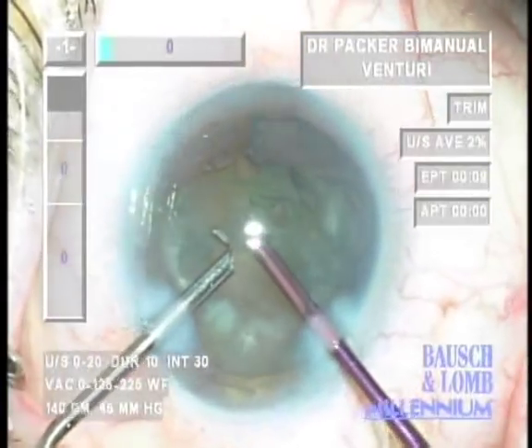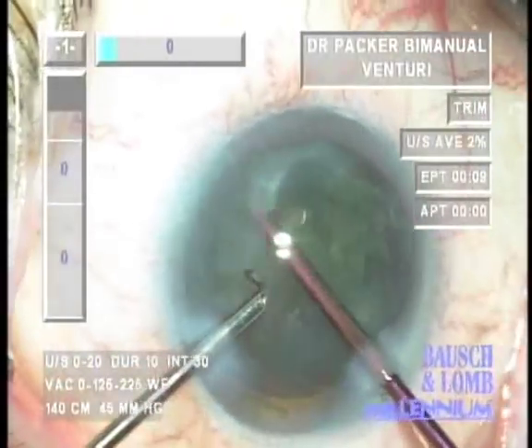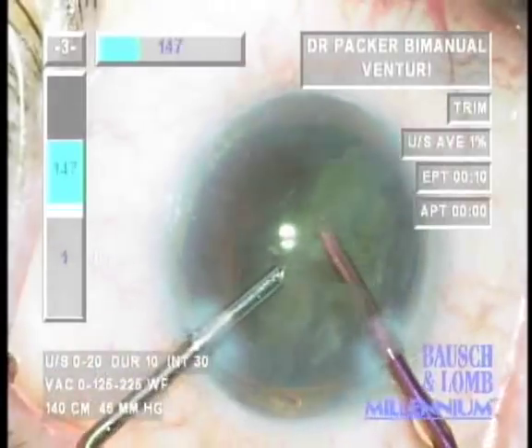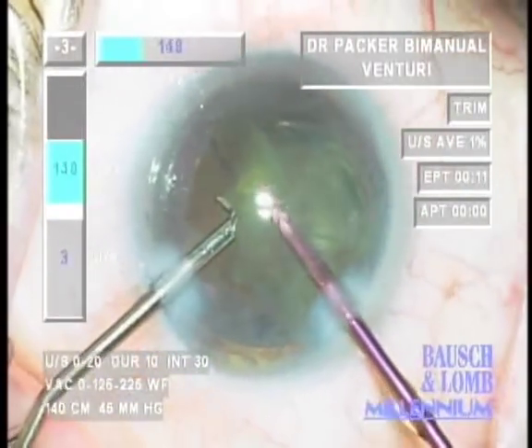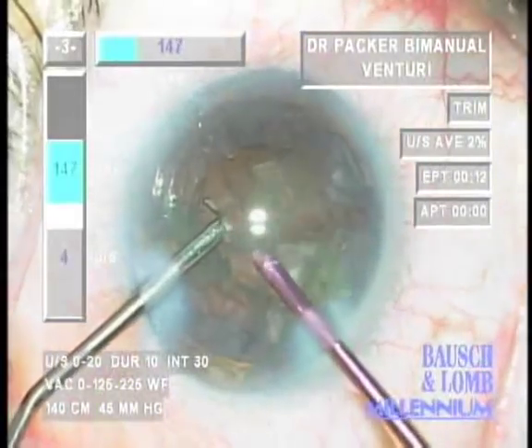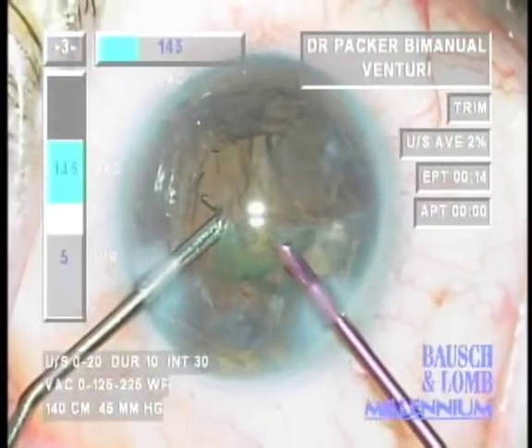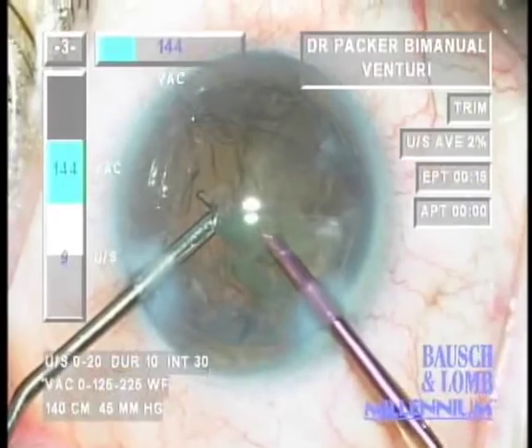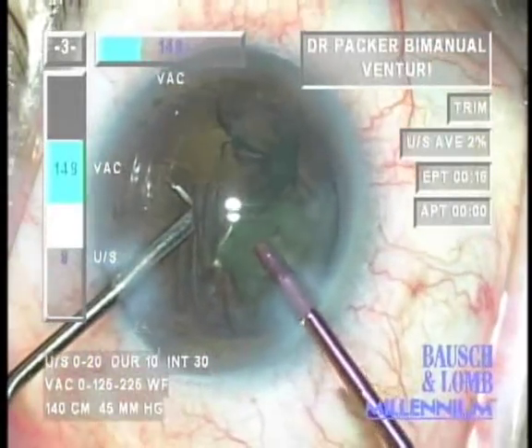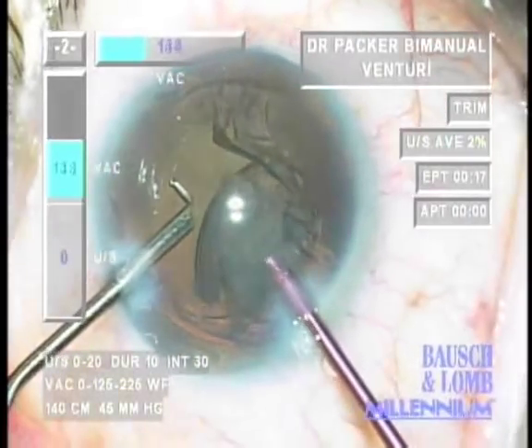Following aspiration of the nucleus, the epinucleus is addressed with a different setting — reduced power and a slightly lower vacuum. As the epinucleus is trimmed in foot pedal position three, cortical material from behind the epinucleus also flows into the phaco needle. This is the technique of cortical cleaving hydrodissection, originally described by Howard Fine in 1992. About 70% of the time most of the cortex is cleared with the epinucleus; about 30% of the time a small amount of additional aspiration is still necessary.